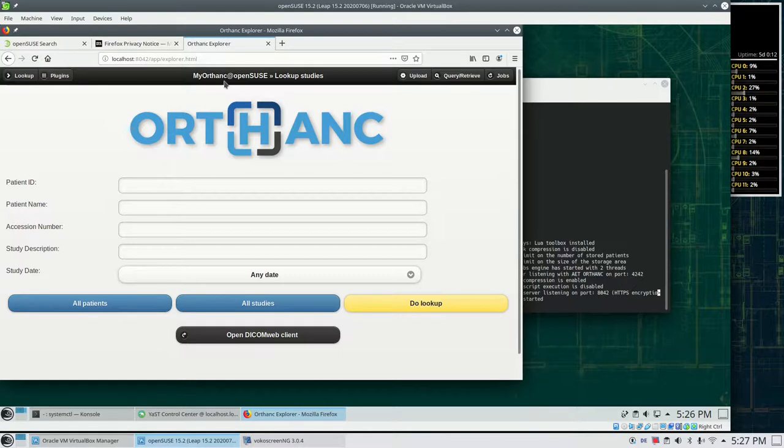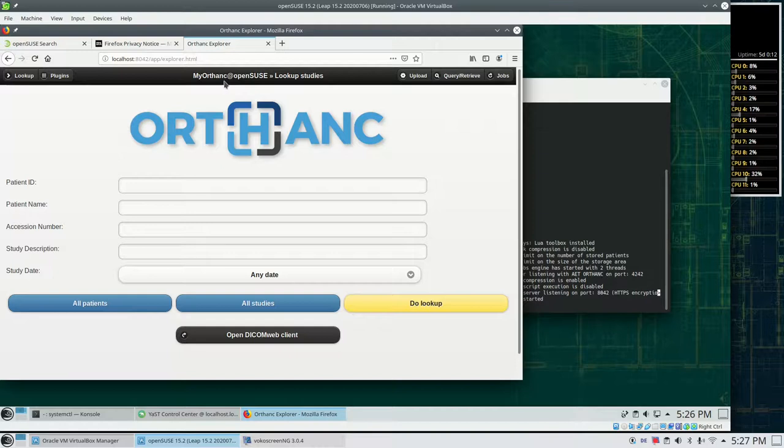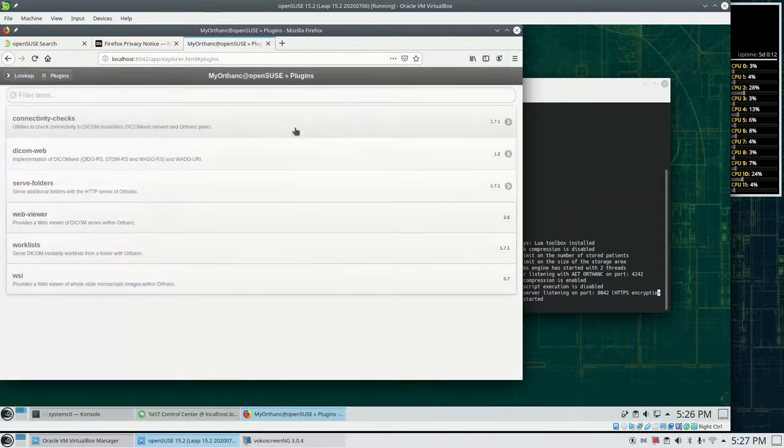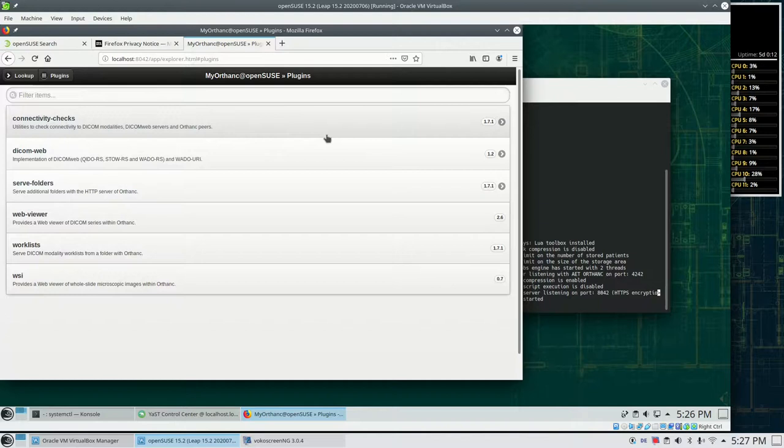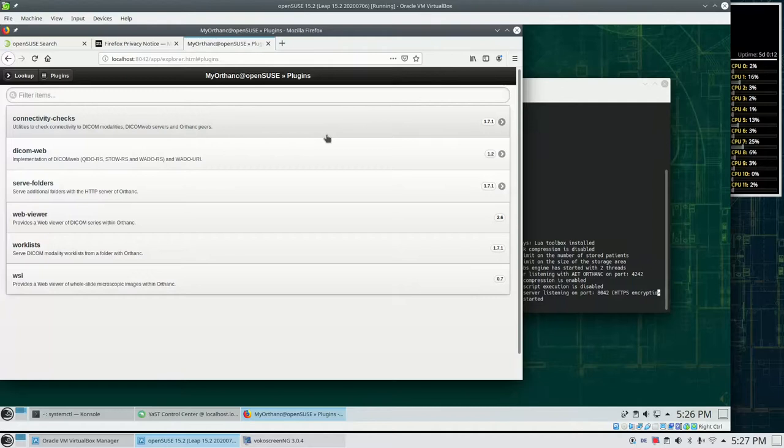For example, with the import of medical images or with the installation of some additional plugins. So if we go to plugins we see what we have already installed. The web viewer, the whole slide imaging, and everything.